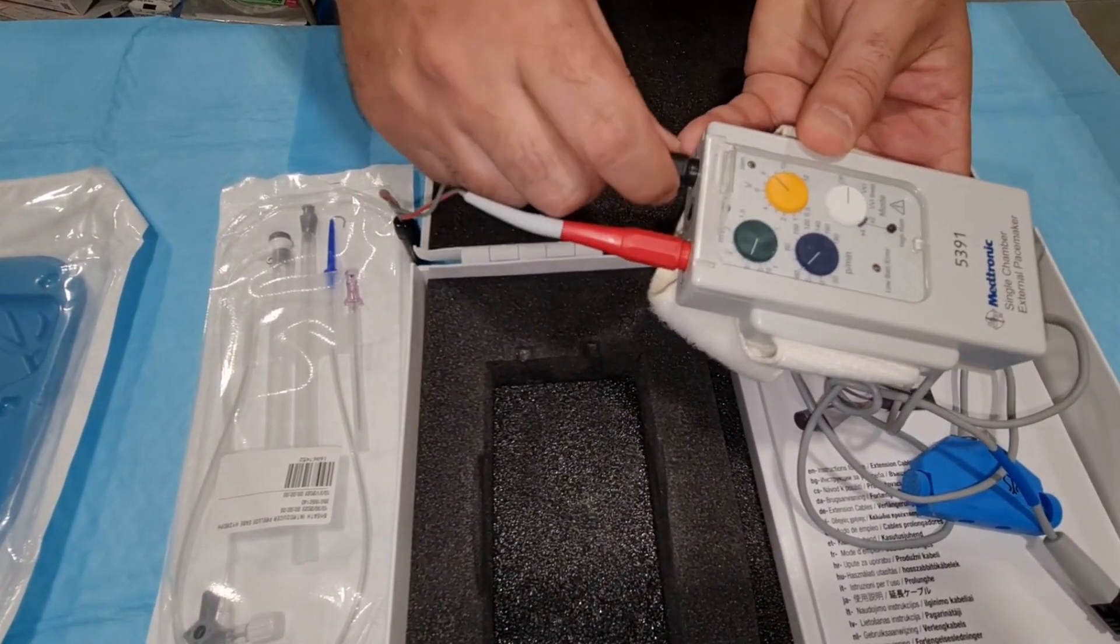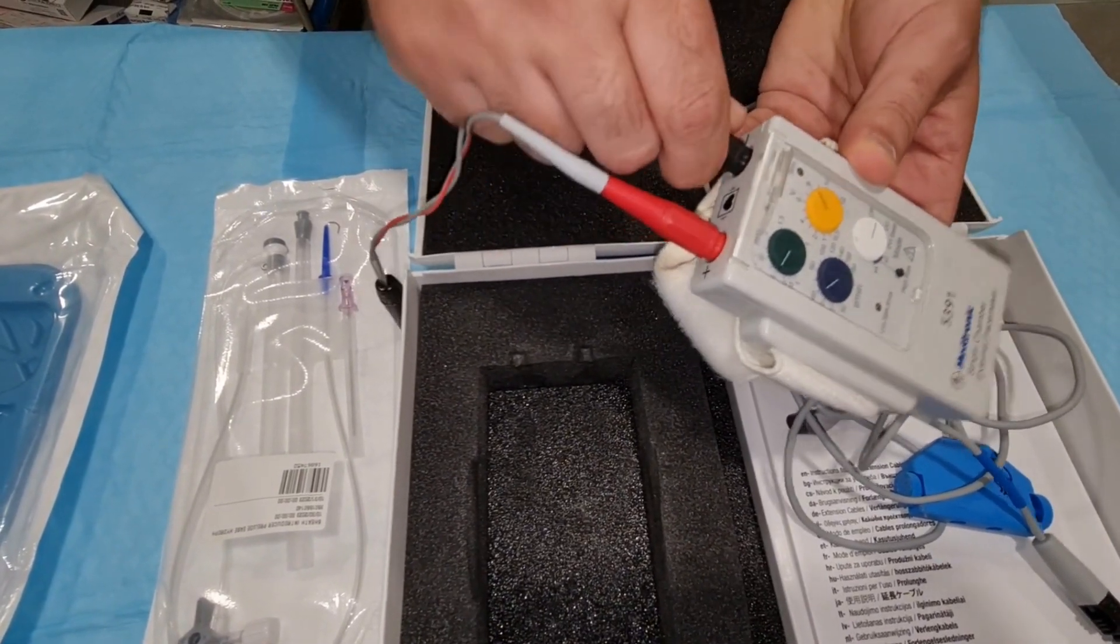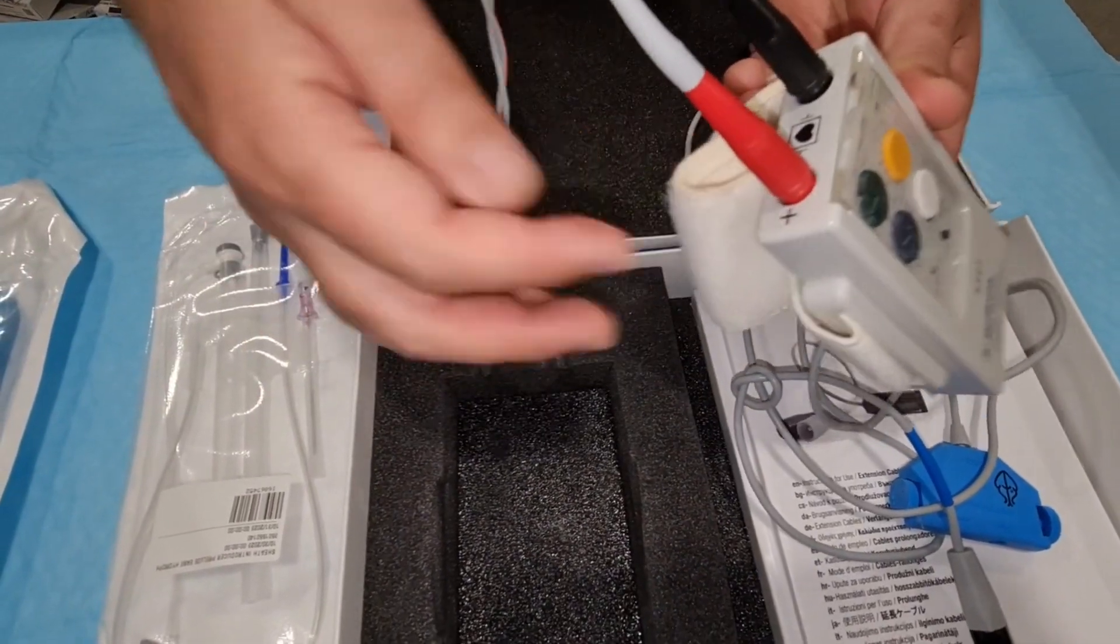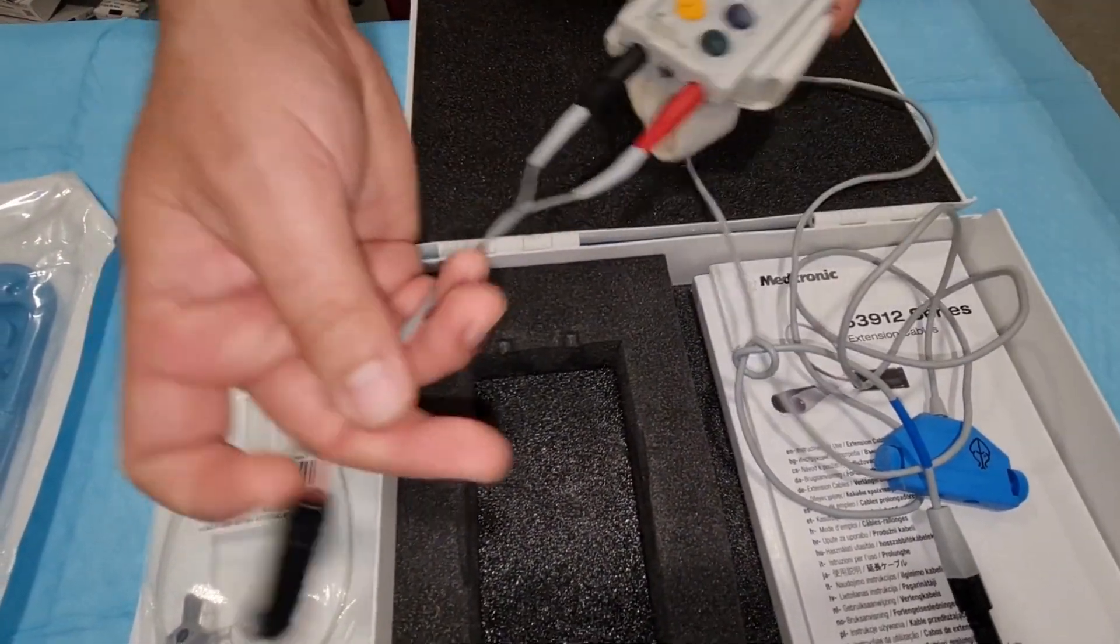Similarly to the next one, this is positive and negative. The black is negative and the red is positive. Now, we are connected with the connector.